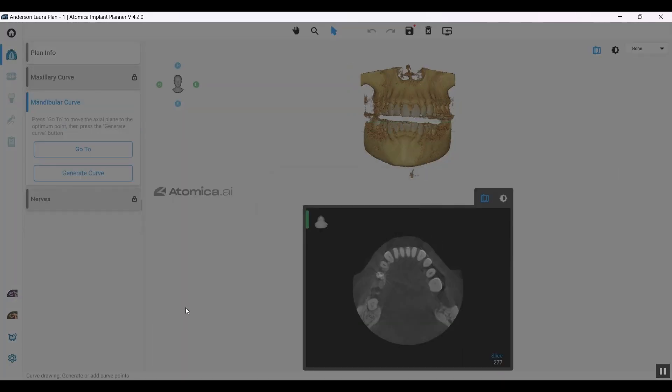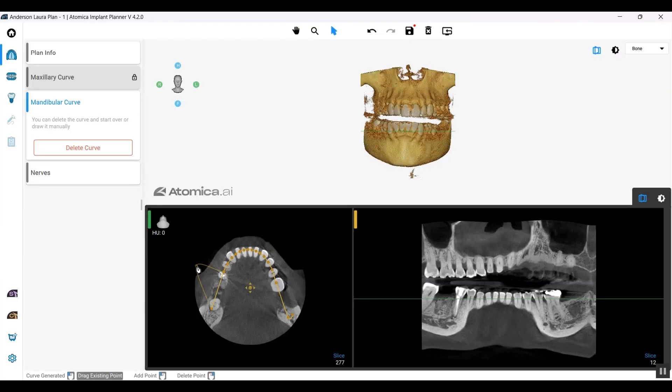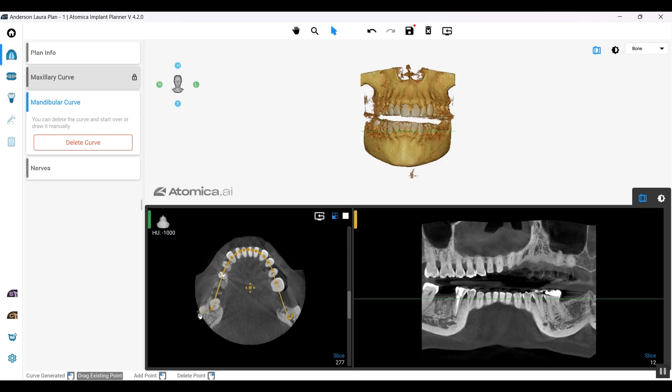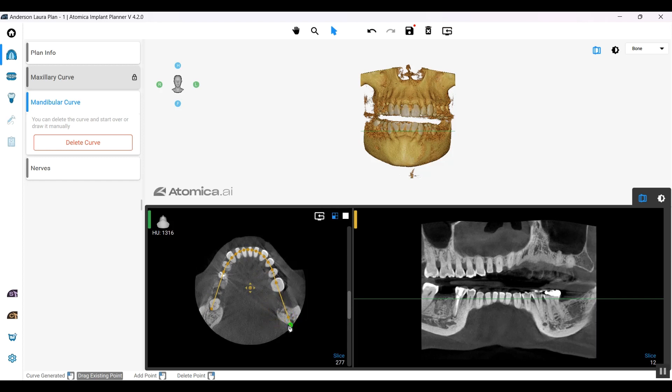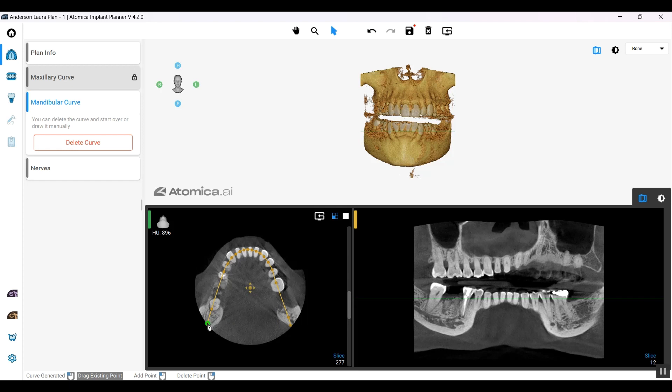As soon as I tap on the mandibular curve, you'll find that the panorama curve has been generated automatically using the power of AI. You can also do manual adjustments and add your own dots the way you want it to be.